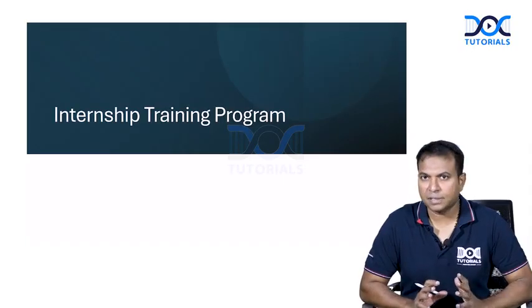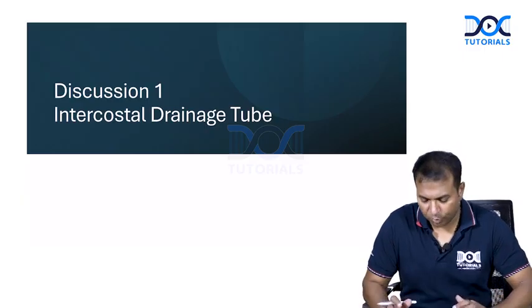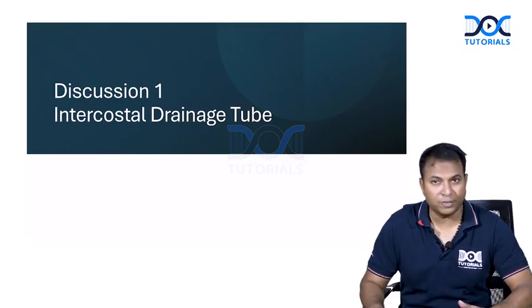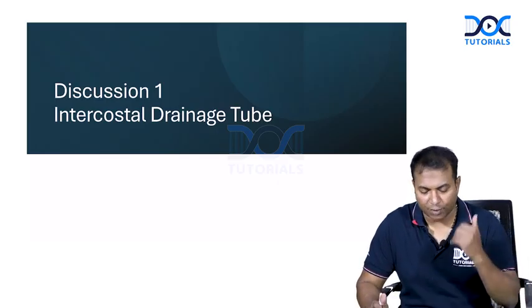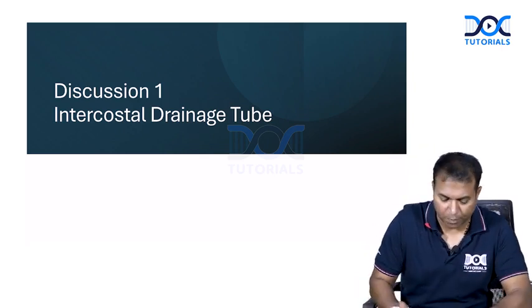Welcome friends, let me discuss the brief outline before going to the mannequin explanation. Let us start one by one. The first topic we are going to discuss, as an intern you should know everything about intercostal drainage tube. Some basic things as an intern you should never forget, and one of the most important things is putting an intercostal drainage tube. So one of the most important topics, please focus.